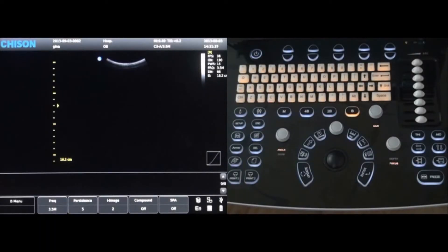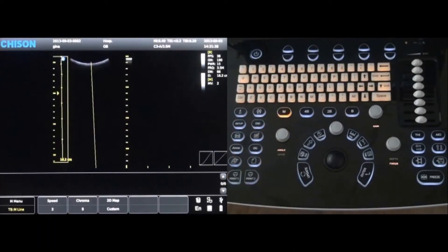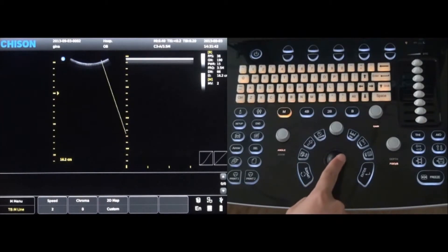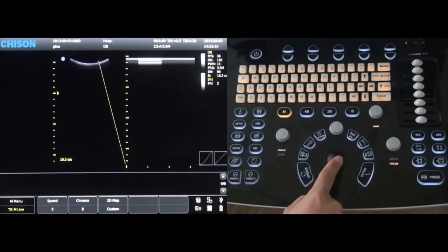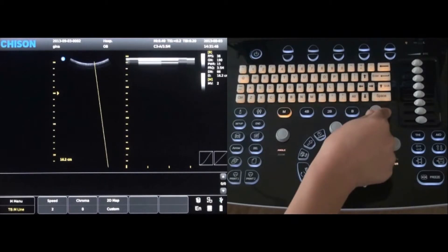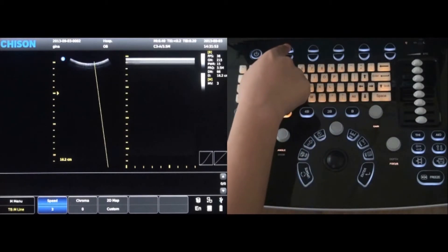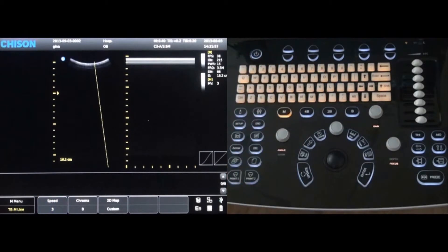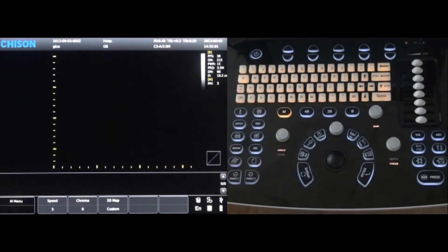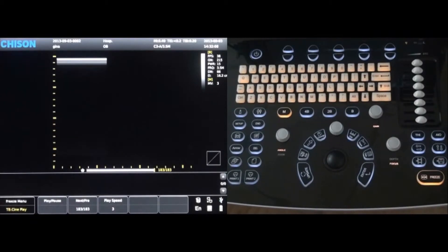To enter M mode, press the M key. By moving the trackball, the M cursor position can change. The gain can be adjusted by rotating the gain key. The first key at the top of the keyboard will adjust the M mode scanning speed faster or slower. By pressing the M key again, the image will be shown on the entire screen for a larger visual. Simply press the freeze key when the desired image is shown.